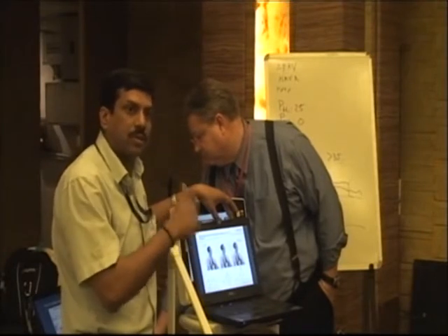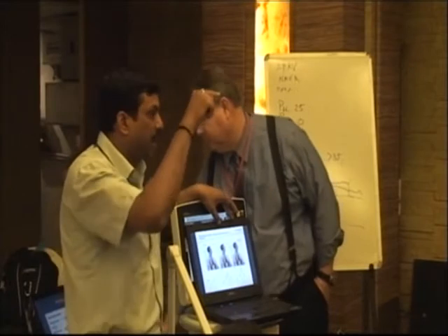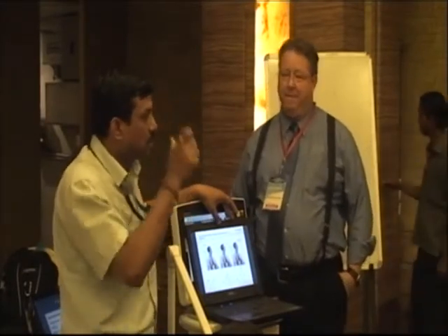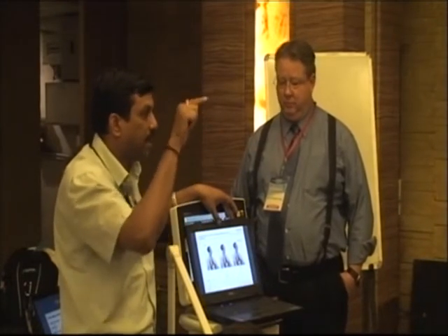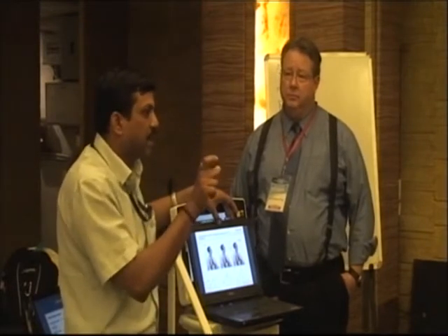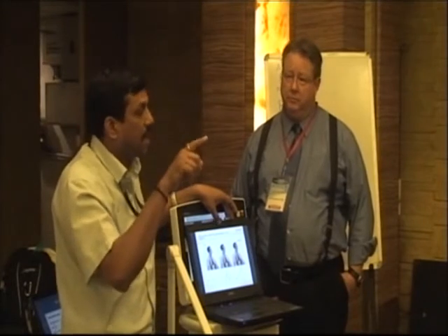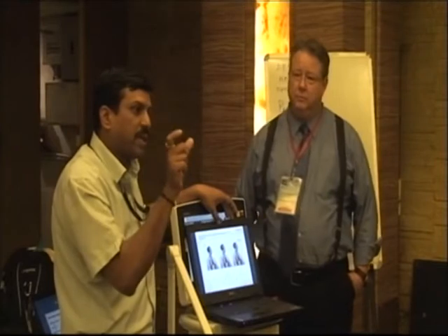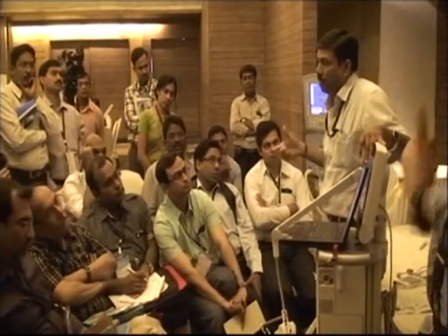We don't have to set a pressure support. We just set the NAVA level. Depending on the EDI peak and EDI minimum, the pressure is adjusted. If there are strong signals coming from the patient, we will get a good tidal volume depending on the EDI high and EDI minimum. So whatever NAVA level we set is multiplied by EDI high minus EDI minimum, plus PEEP. That will be the pressure support. So the pressure support will keep on changing according to the NAVA EDI signal, how much the diaphragm pulls.